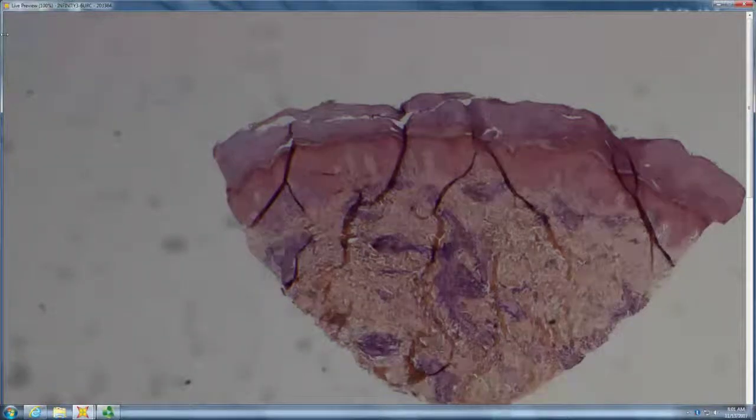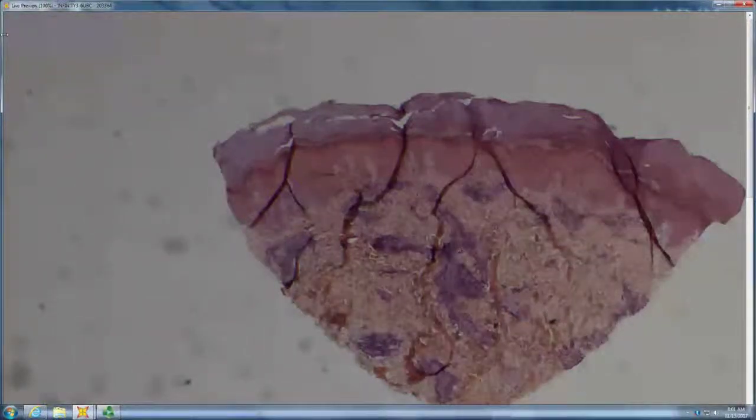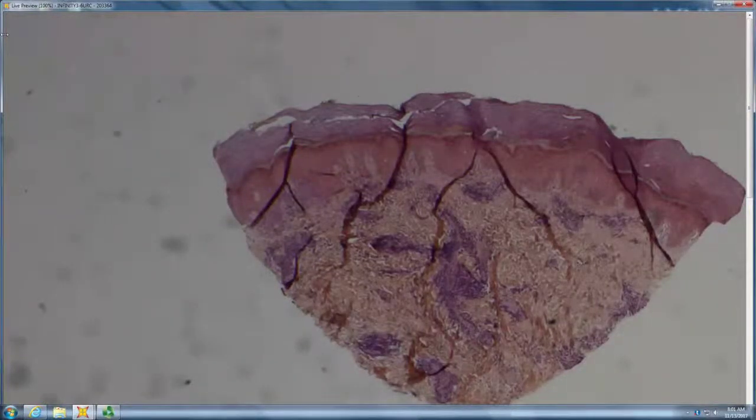How about this? So we have pretty broad shade. We have RBC extravasation. Tell me about the vessels. They look like they're tufted. So they're tufted, which tells you, first off, where are you probably? Most likely on the shin. Most likely on the shin. And is this a normal lumen, or is that a lumen that's not much bigger than a red blood cell? I think the latter. It's the latter, and look how thick the walls are. Look how much amorphous pink there is there.